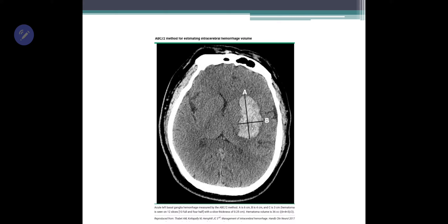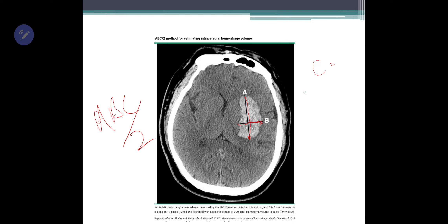To calculate the size of a bleed, go to the slice with the maximum bleeding. One dimension is A, one dimension is B. The formula is A × B × C divided by 2. C is the number of slices showing the bleed multiplied by the distance between slices. For example, if you have four slices with 0.25 cm between them, C equals 4 × 0.25 = 1 cm, giving you A × B × C ÷ 2.